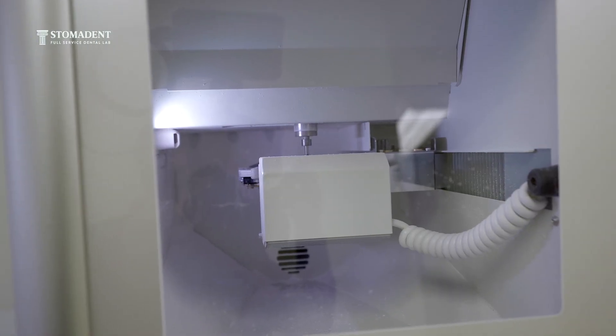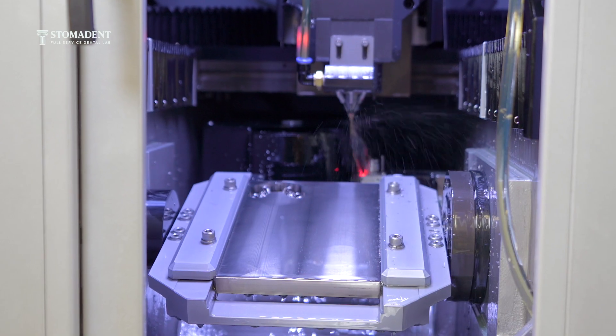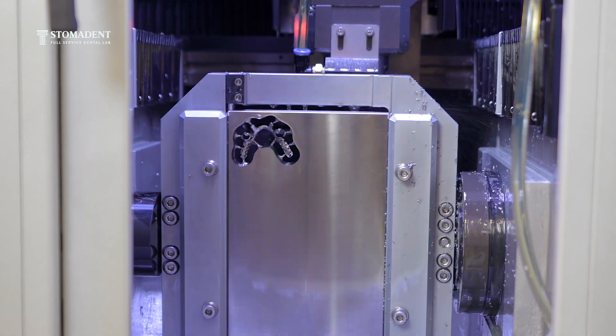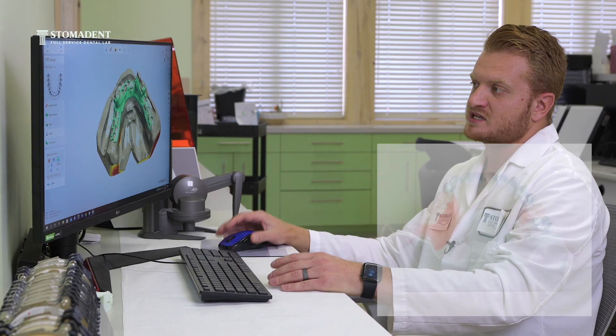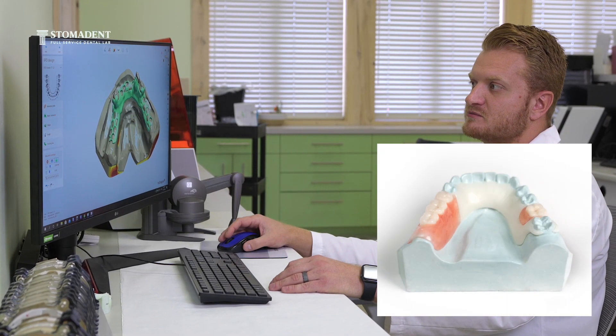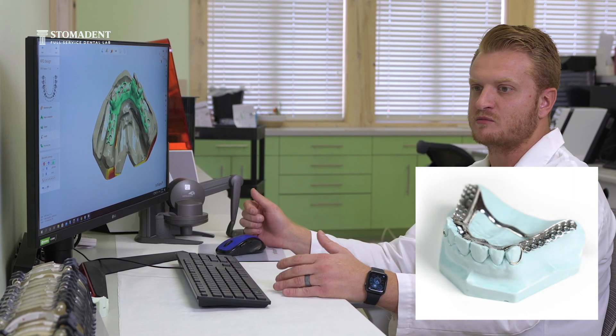Whether we are 3D printing our wyronium frames and then casting them here, or we are designing our acetal frames and our titanium frames and milling them — also in-house.